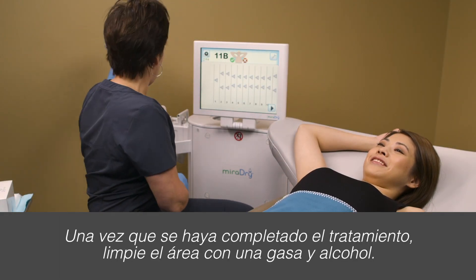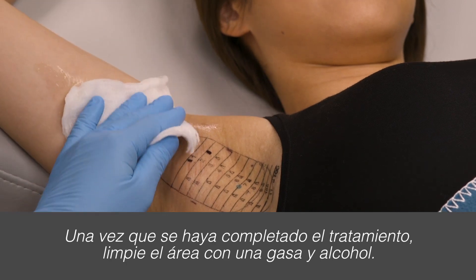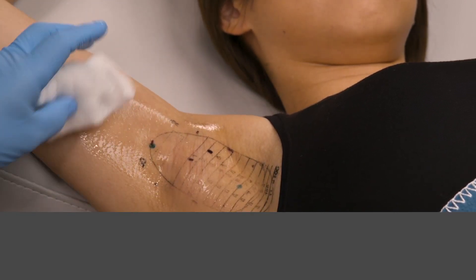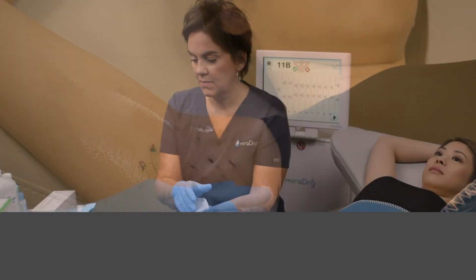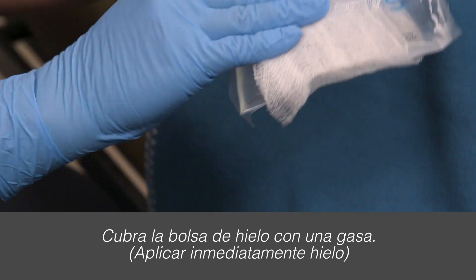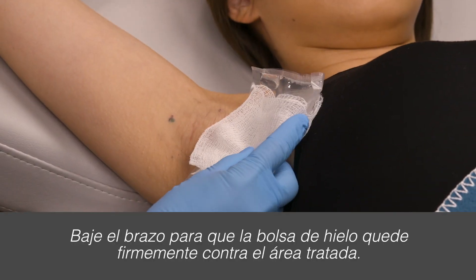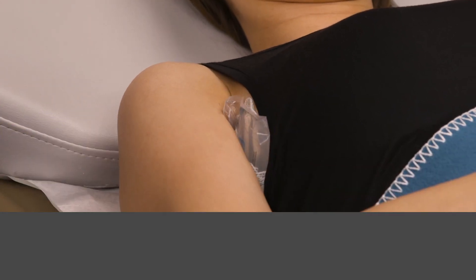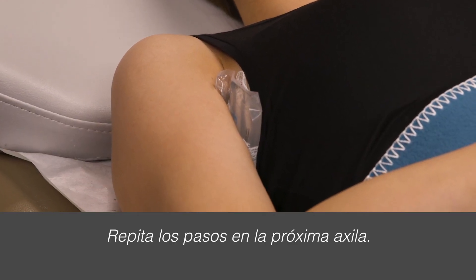Once treatment has been completed, clean the area. Cover the ice pack with gauze and lower the arm so that the ice pack is firmly against the treated area. Repeat the steps for the next underarm.